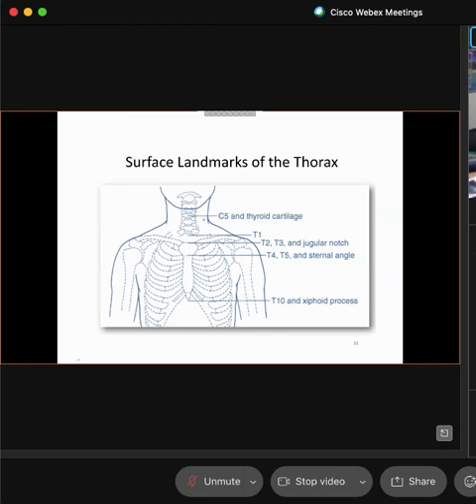So when we look at C5, what did we position in your history of learning? What did we position around C5? What was our objective? Upper airway, absolutely, Isbeli. Upper airway. So we knew that if we were going to place our central ray horizontal axis at C5, we were not looking for the thorax. Our thorax is not the objective. The airway is. Make sense?